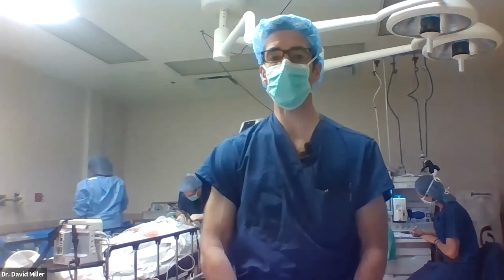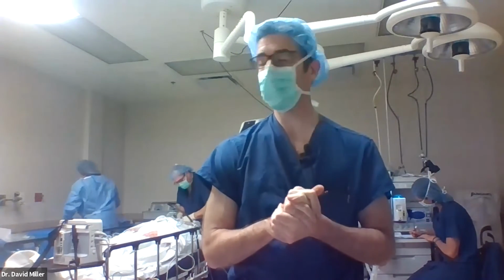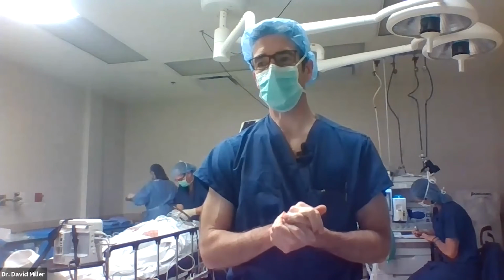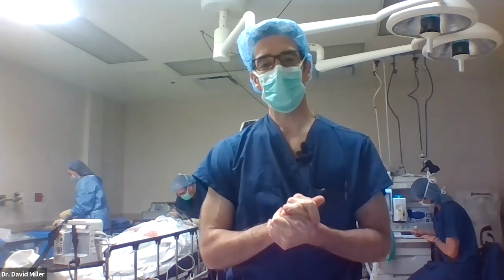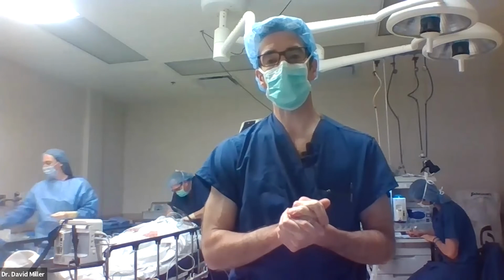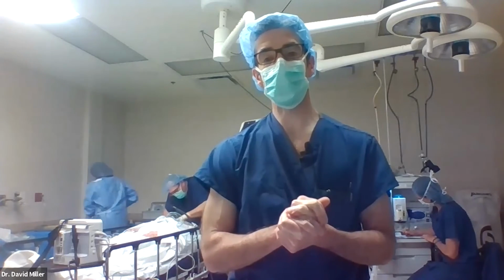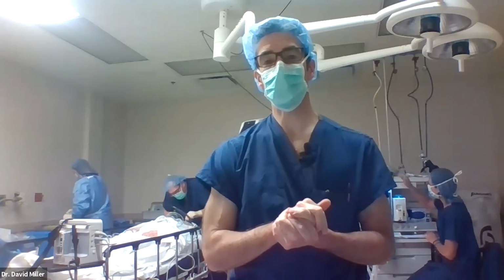How do you control intraocular bleeding? The best rule in intraocular bleeding is not to get any, right? So if you're in a retinal detachment case like the first one, we really don't expect to get intraocular bleeding. We don't want to hit the retina accidentally, cut open a retinal vessel. We do use cautery to create the retinotomy site. Some people do not. I think that can lead to a little more bleeding. You don't want to bounce into the RPE or the choroid, which are vascular rich and can cause bleeding. You can sometimes get unavoidable bleeding just from the wound creation, putting in the trocars. I think the best way to control that is with elevated intraocular pressure and waiting a few minutes.